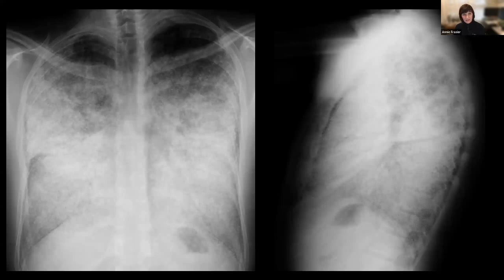On the lateral view and maybe even on the PA view, you can see that there is this extreme juxtapleural kind of sparing. It looks like a fine, dark, lucent stripe.